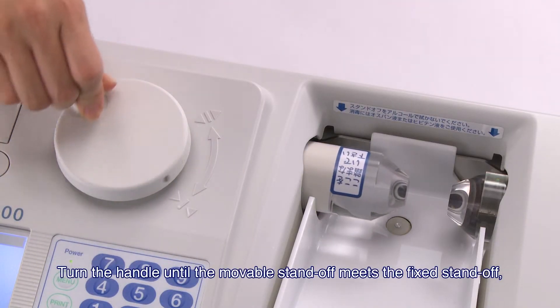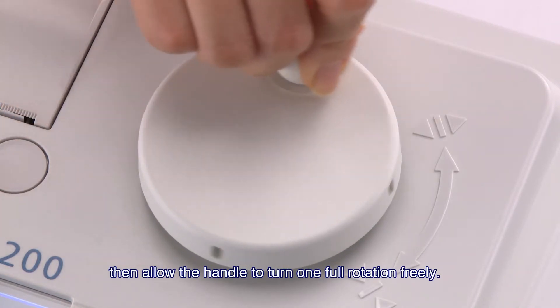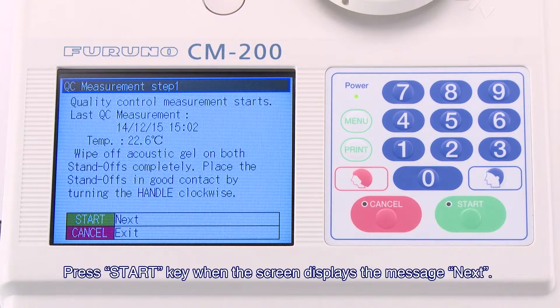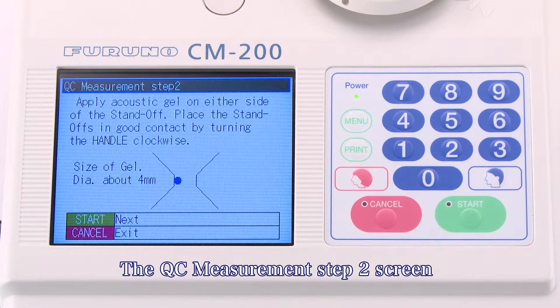Turn the handle until the movable standoff meets the fixed standoff. Then, allow the handle to turn one full rotation freely. Press the Start key when the screen displays the message "Next." The QC Measurement Step 2 screen is displayed.